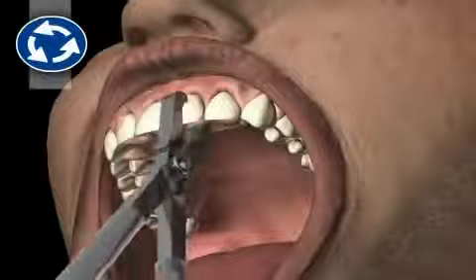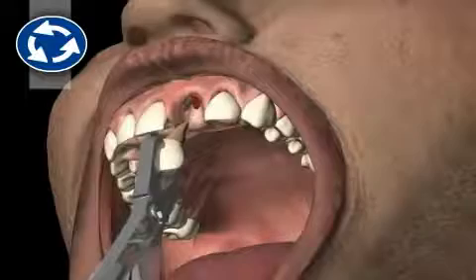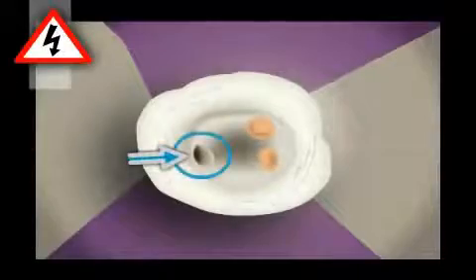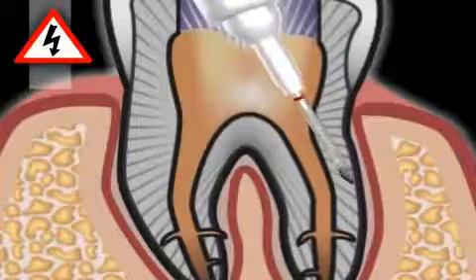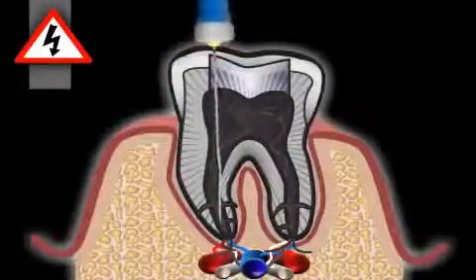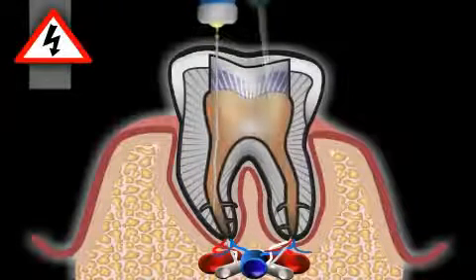One possible alternative to a root canal is a tooth extraction. That makes prevention the best alternative. The risks associated with a root canal are instruments breaking during root canal treatments, the dentist missing root canals, a perforation of the canal and the dental crown, over-instrumentation with respective possible consequences, such as maxillary sinusitis. You can learn more about possible problems with root canal treatments in the video entitled Complications in Root Canal Treatments.